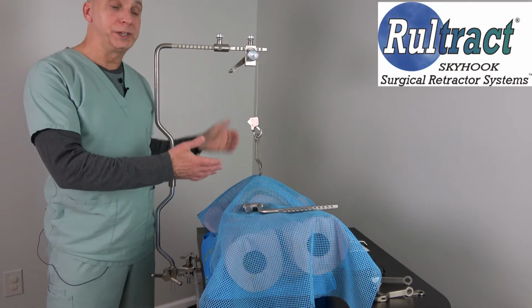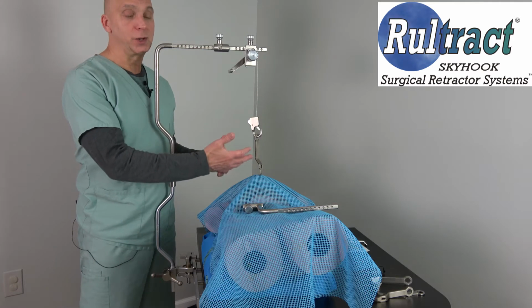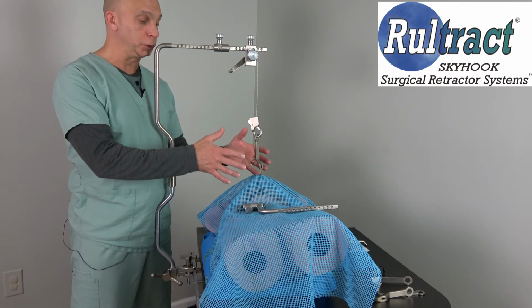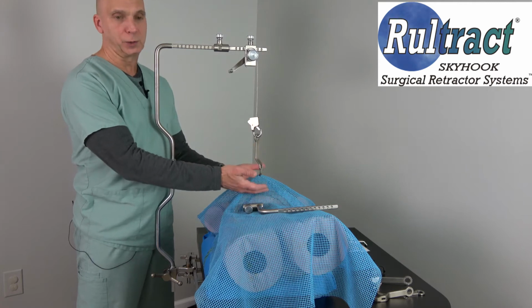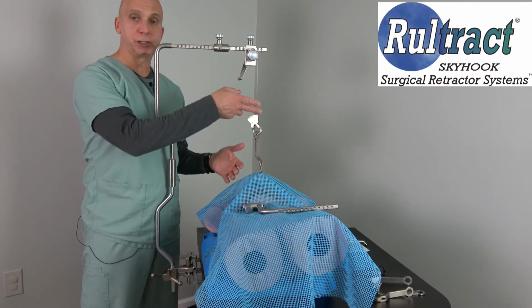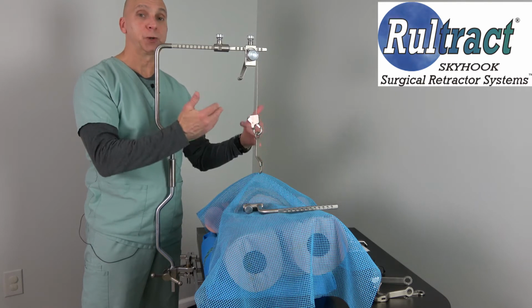Something that I want to point out is if you have an obese patient, you're going to need additional height because you may run out of cable in trying to retract the incision. So what I'll do now is show you, first we have an average size patient on the table here with a retraction at the xiphoid for a pericardial window incision. And with an average size patient, you can see we have plenty of cable available to continue to retract.